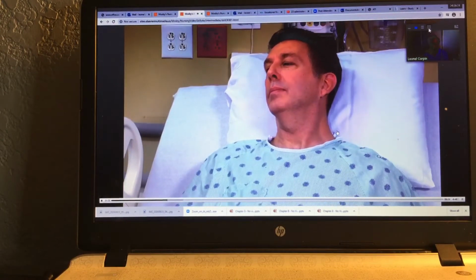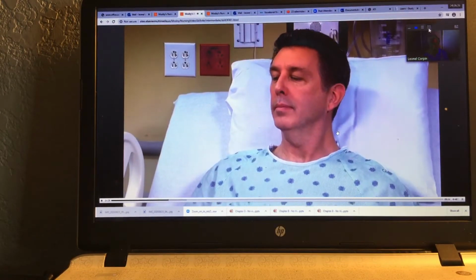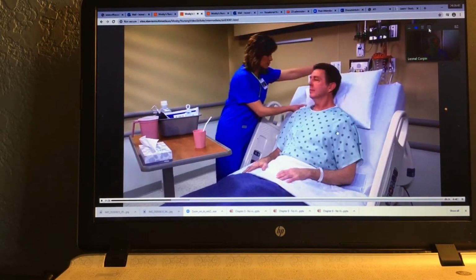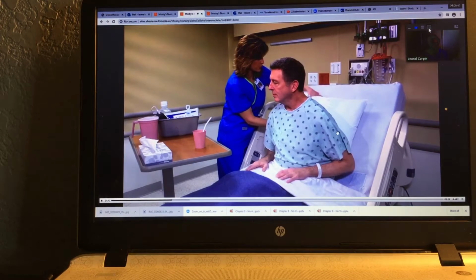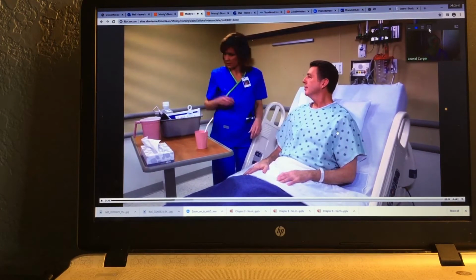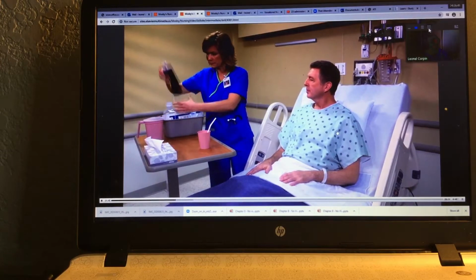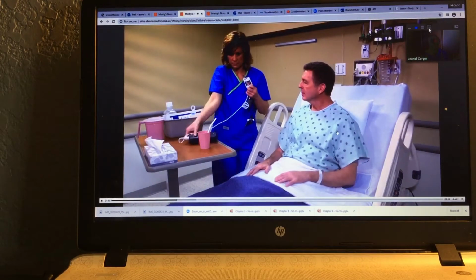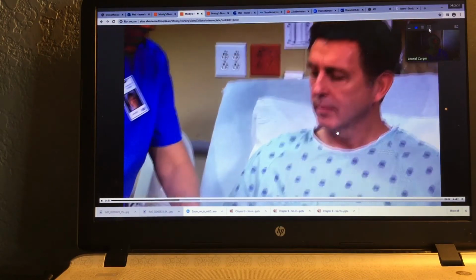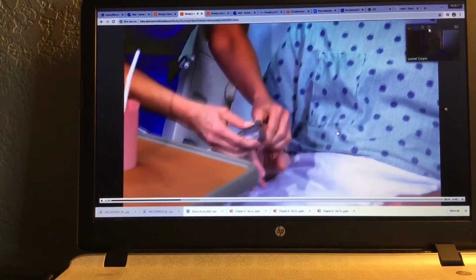Place the patient in the high Fowler's position unless doing so is contraindicated by his condition. If he's comatose or confused, raise the head of the bed and ask an assistant to help you place him in the semi-Fowler's position. If he must remain supine, place him in the reverse Trendelenburg position. Affix a pulse oximeter and take his vital signs.